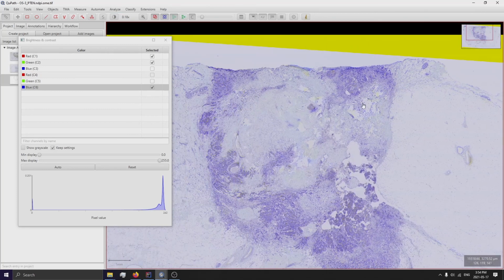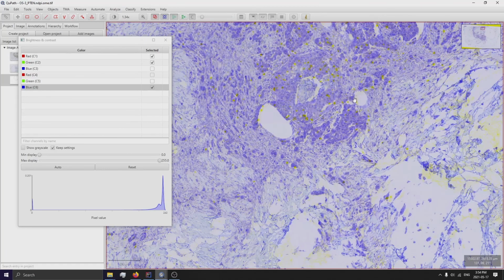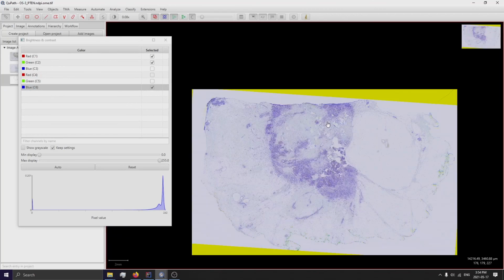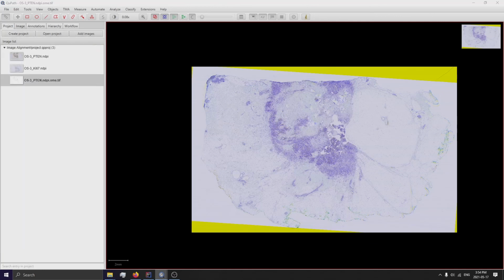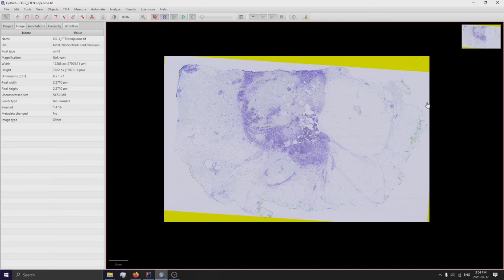Does a reasonable job. I've used it for a lot of my projects, and I've never had an issue with any of the outputs. Keep in mind, if you do want to write out an image in its original resolution, you probably wouldn't want to work with an image of this size. It's about 12,000 pixels long. Quite a lot of data.